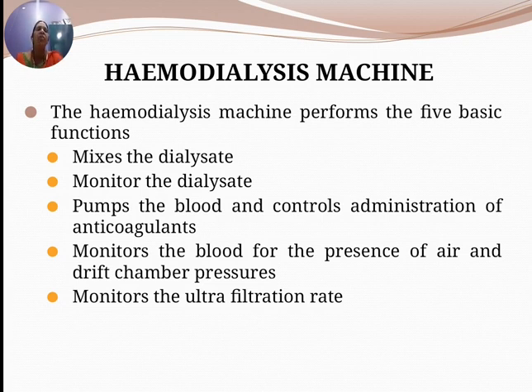So the hemodialysis machine performs 5 basic functions.